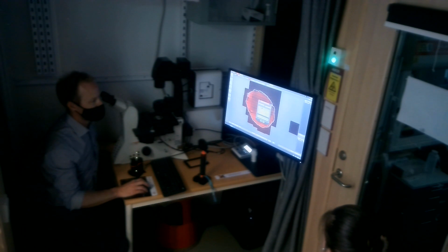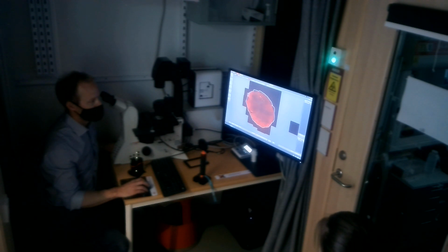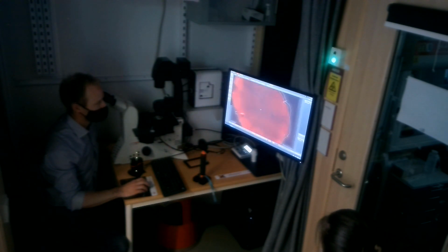And for me now, I don't mind at all. It can go all the way out if it wants. And then let's go with setting focus points. Could be a good thing here. Maybe I want to take, say, 6 and go OK. So now it placed out my frames over the tissue. It actually did not put the focus map.